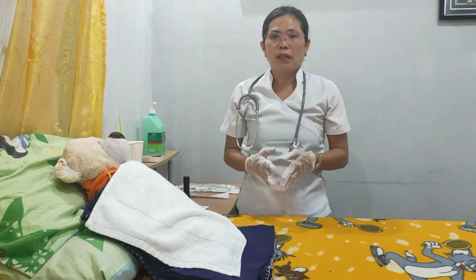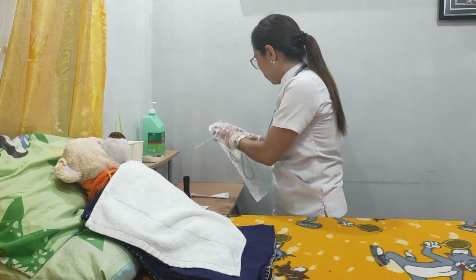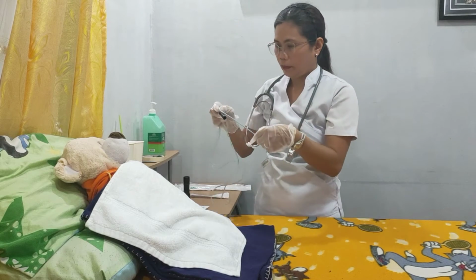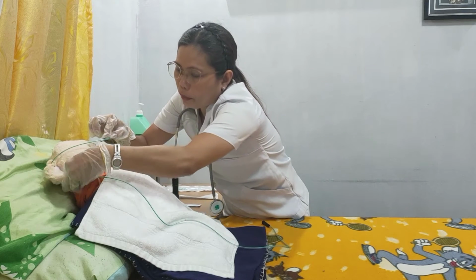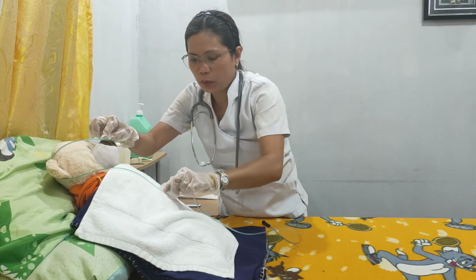Make sure of the distance to insert the tube by measuring. Place the tip of the tube at the end of the client's nostril extended to the tip of the earlobe. Starting here, up to the earlobe, and until here in the xiphoid process.